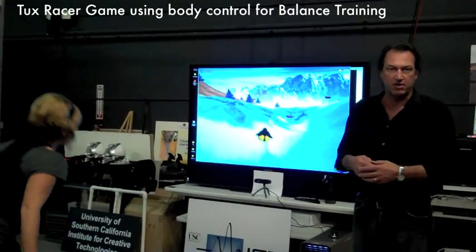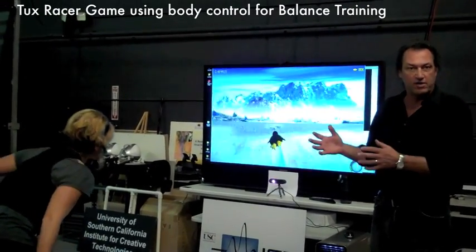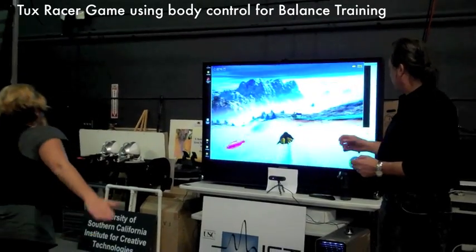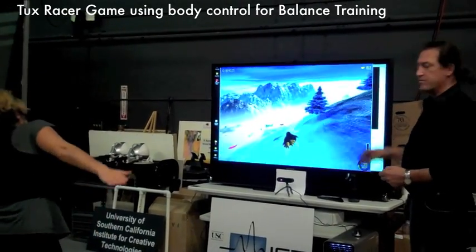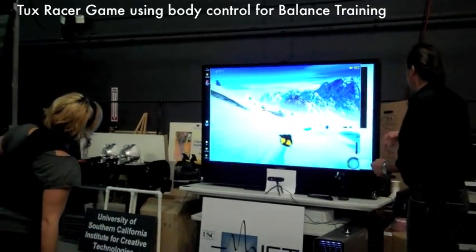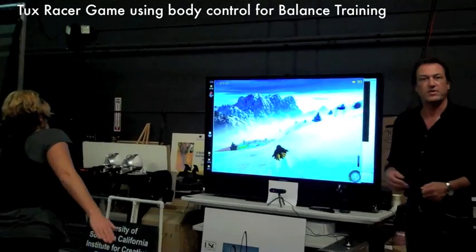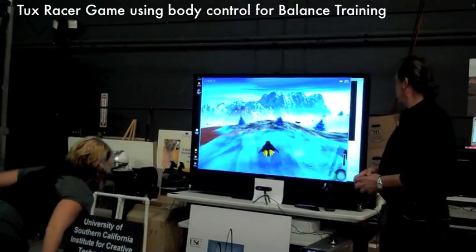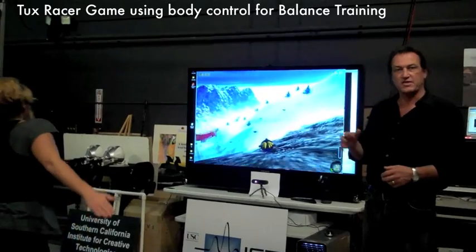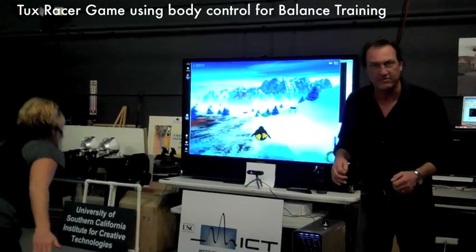We can take that articulated skeleton and actually track that movement without any wires, again with the camera. The user can now drive this little penguin from the Tux Racer game down a ski slope and try to collect little prizes as she goes down. This way we can foster balance training. As the user moves from side to side, the penguin moves from side to side. If she leans forward, it goes faster; if she leans back, it slows down.